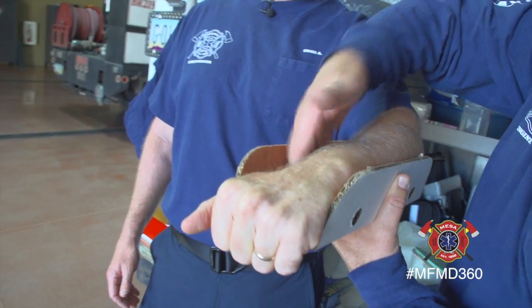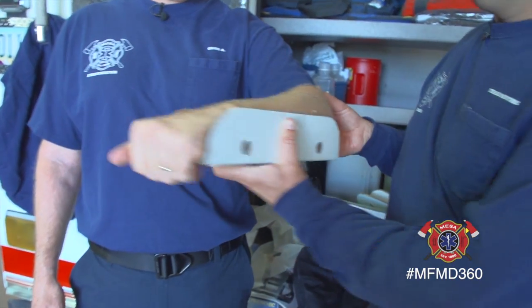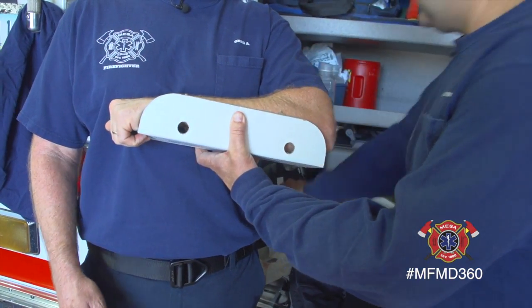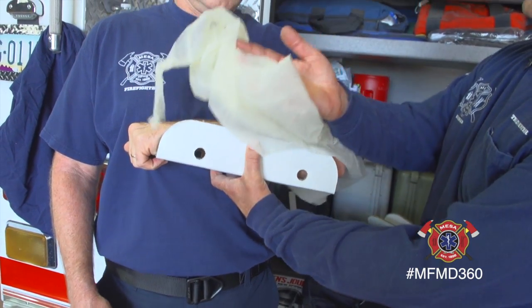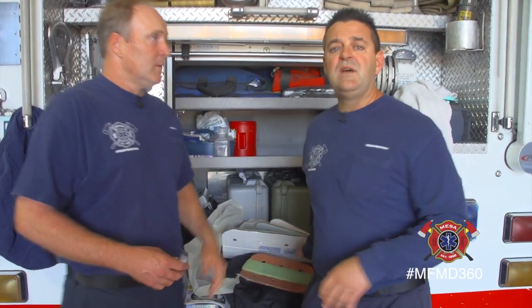You want to put it in a position of comfort. You might have to put some padding down. Then we'll take tape or gauze, wrap that, and bring it into their chest. We could put on a sling and wrap it around so it's in a position of comfort. We have the ability to give pain medication, so we'll probably give you something to help with the pain and then transport you to the closest facility.